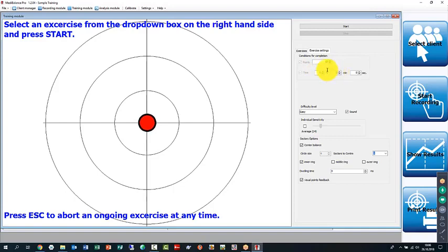Don't put 2 minutes here, it's 2 hours, that will be a little long. And then you can also adjust a lot of things here, like how big should the center of mass be? Do you want a smaller circle there, which I will put in here right now, or a bigger one?